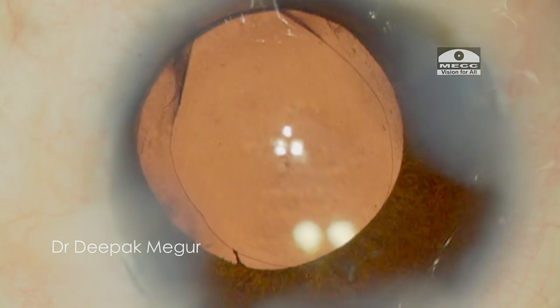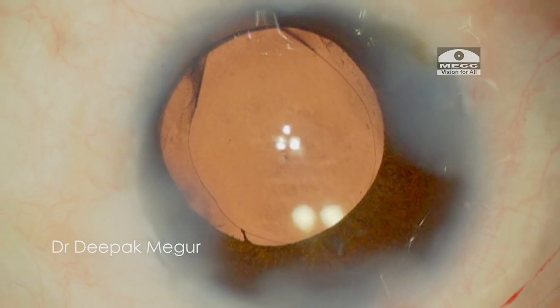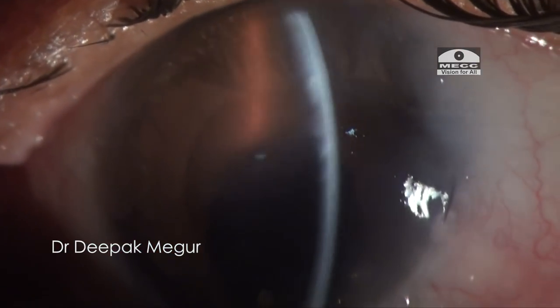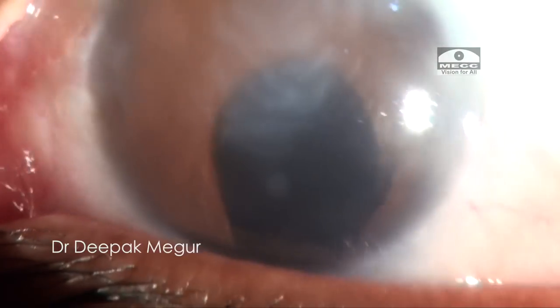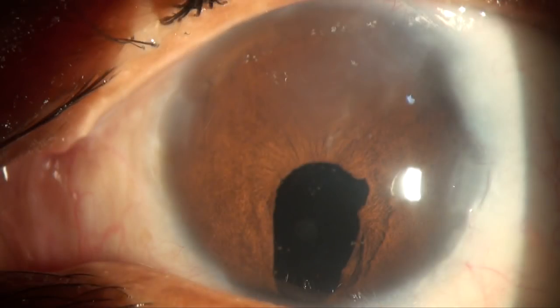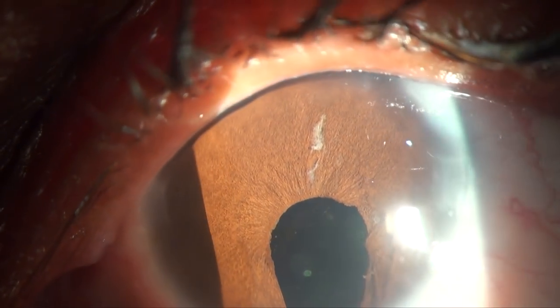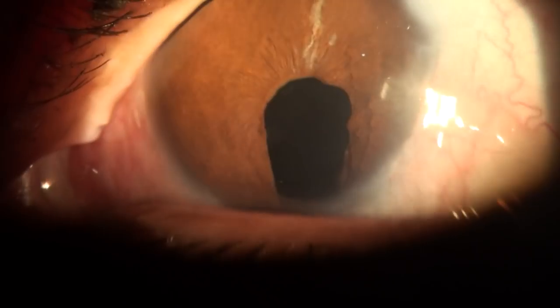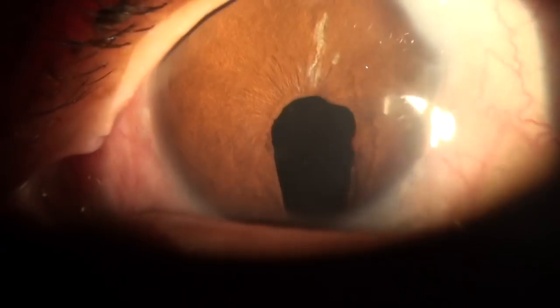We could manage to come out of a tough situation quite satisfactorily. Four hours later, significant corneal edema in the superior hemisphere is seen — this was expected, as emulsification was done in a much more anterior plane, resulting in mechanical trauma to the endothelium. On the 4th day, the cornea clears off a little bit and the edema has significantly decreased. By the 11th day, the cornea is sparkling. Eventually, the patient did have a good visual outcome and is back on the job.